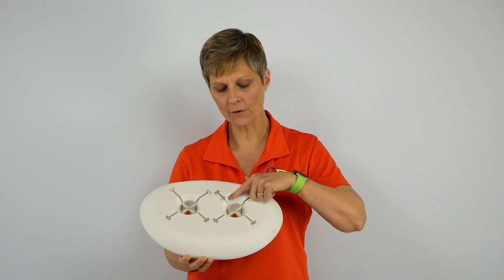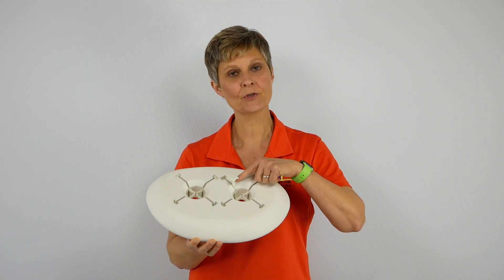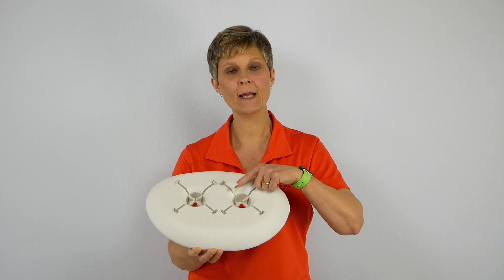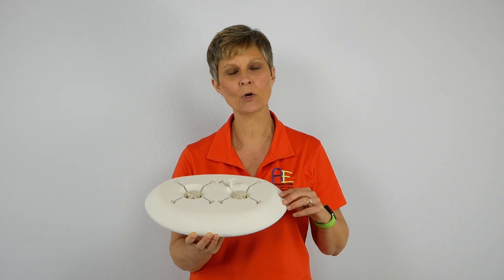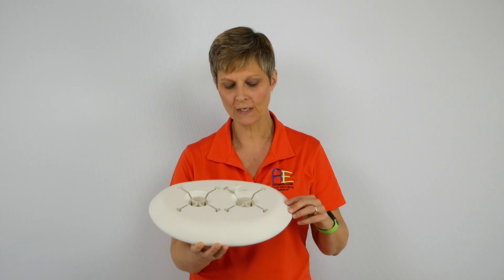Now each lever arm is actually glow in the dark. So when you store this during the day, put it in a nice lit area so that you have the glow in the dark properties at night so that you can see where this is.